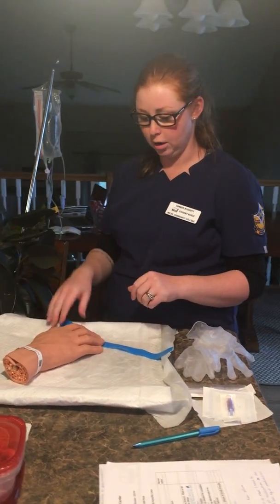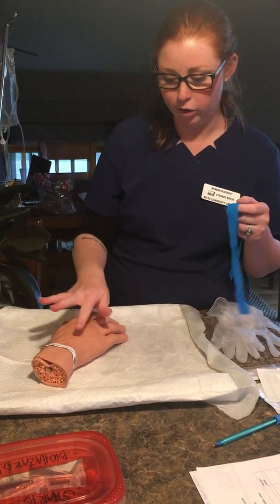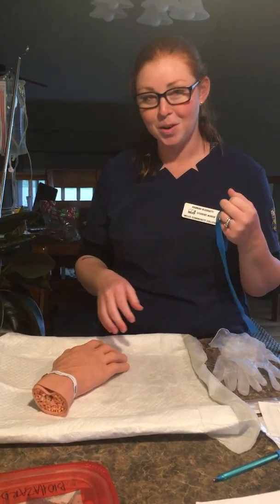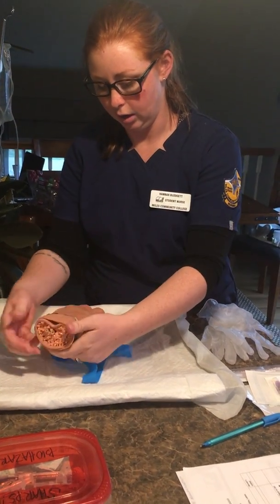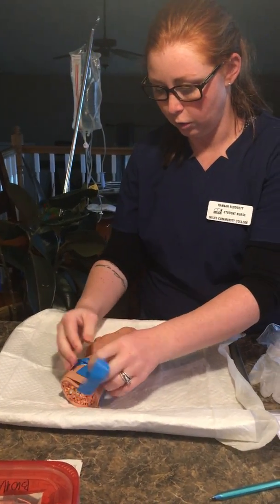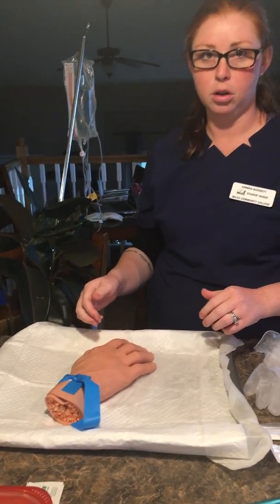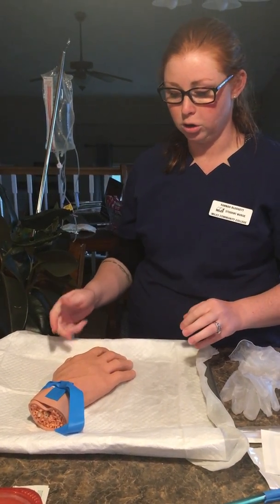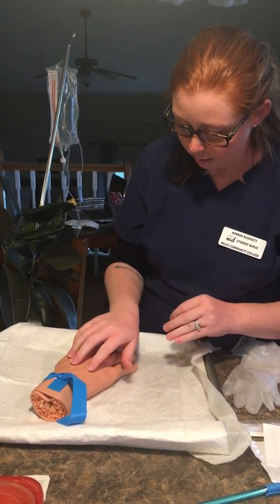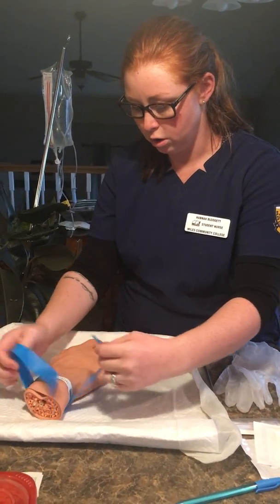Then I'm going to look at her hands — in this case we're using her hand. Generally you would apply a tourniquet four to eight inches above where you're going to be placing it. After I apply the tourniquet, I want to check for a radial pulse just to make sure I don't have it on too tight — still want some blood flowing. I can see a really good vein right here, so I think we'll use that one.